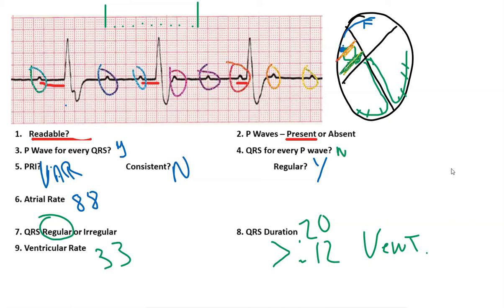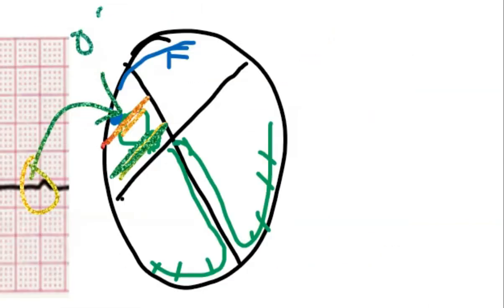And since they're firing, that indicates that this is okay. But what's happening is somewhere between the SA node firing and somewhere along that AV node, there is a problem. So what are we going to find out about that? Where can we tell where that's at? Well, sometimes we can't. But from an EKG, it may give us a good idea of what's happening.